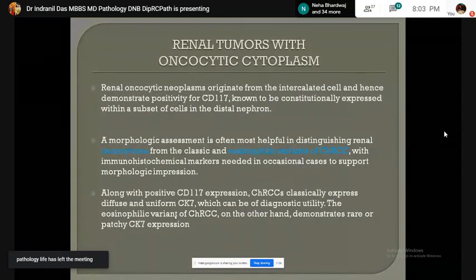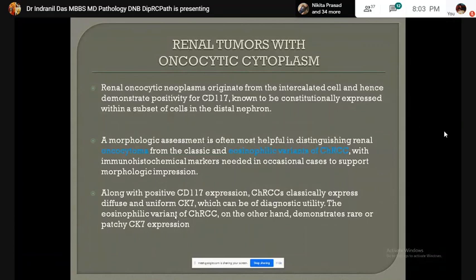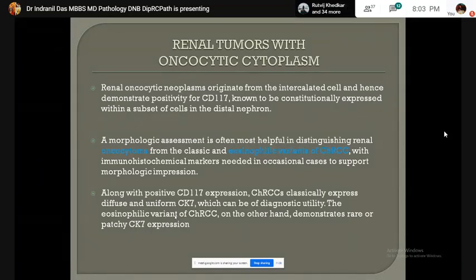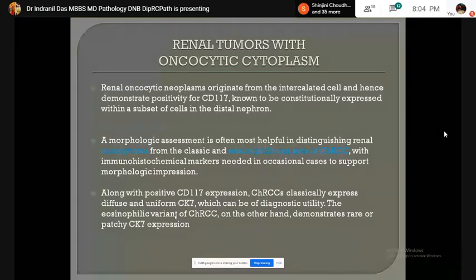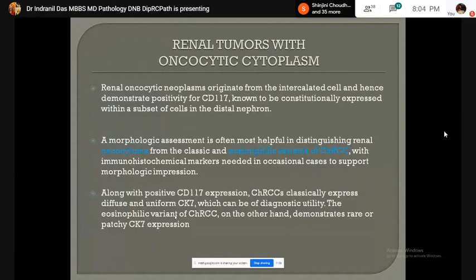Renal cell tumors with oncocytic cytoplasm: renal oncocytic neoplasms usually originate from the intercalated cells and hence demonstrate CD117 positivity. Morphological assessment is often most helpful to distinguish the two primary entities — oncocytoma and chromophobe renal cell carcinoma. Along with positive CD117 expression, chromophobe RCC usually expresses diffuse and uniform CK7, which is not seen in oncocytoma, which shows only patchy positivity.